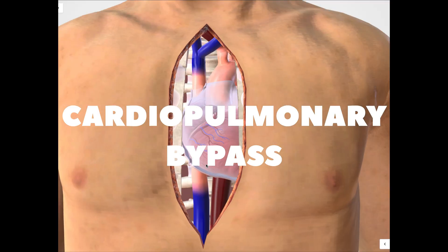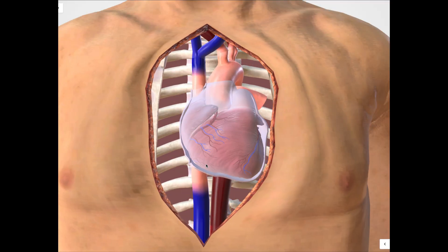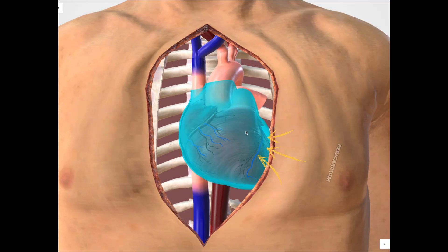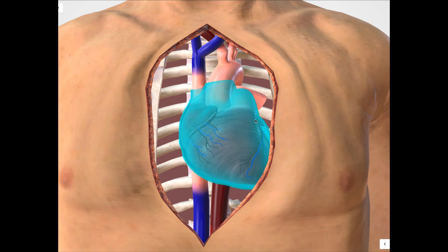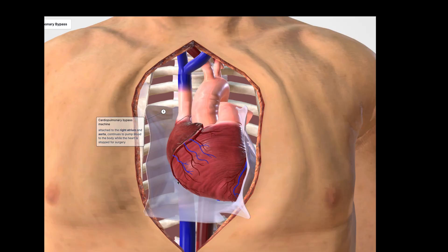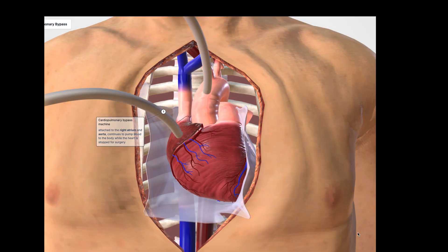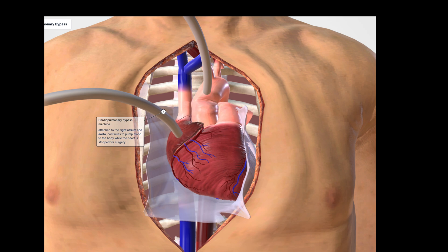The pericardium, a protective fluid-filled sac, is opened to gain direct access to the heart. The heart will then be connected to a cardiopulmonary bypass machine, also known as the heart-lung machine.